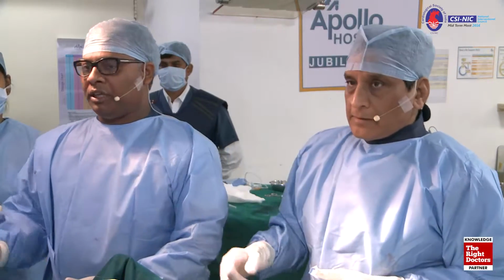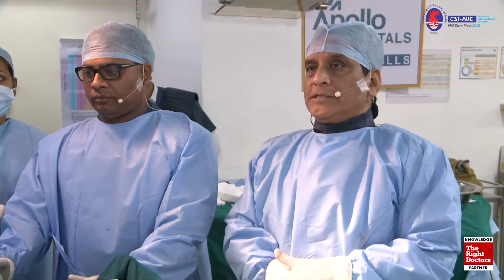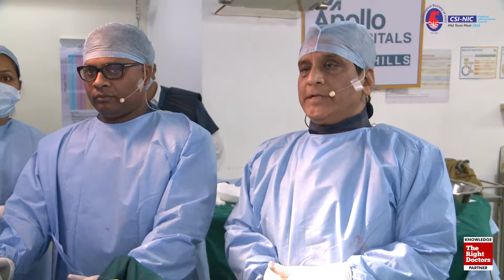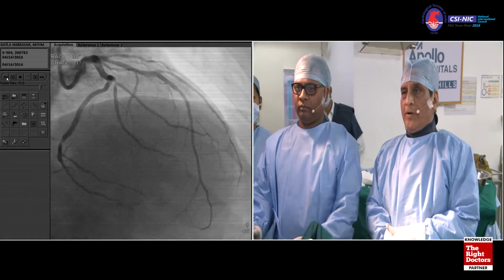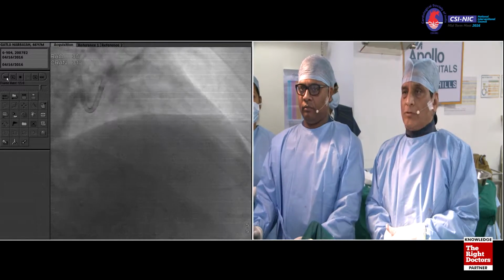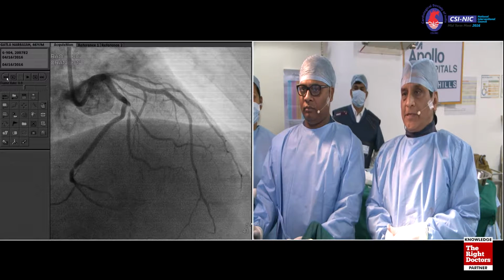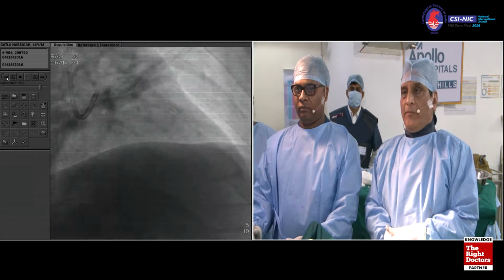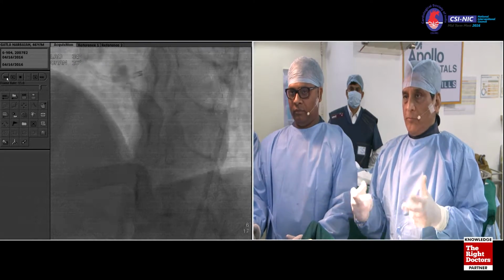Okay, now we are showing the angio. Go to the previous view. So this is the LAD, and you see the diagonal just a little dissected, but normal. Nothing unusual from what was done 5 days ago. The LAD looks like a nicely expanded stent, and there are a total of 3 lesions in the circumflex: the bifurcation OM1, OM2, and LPDA. Next, keep going, a few pictures there.